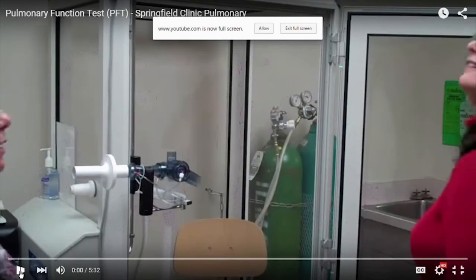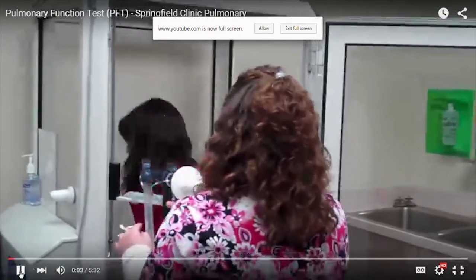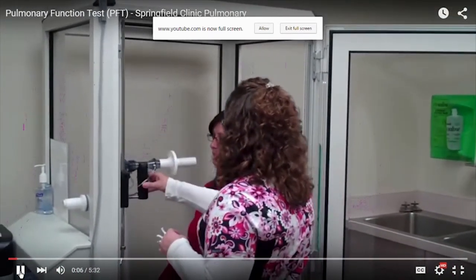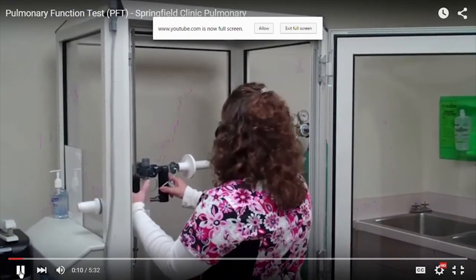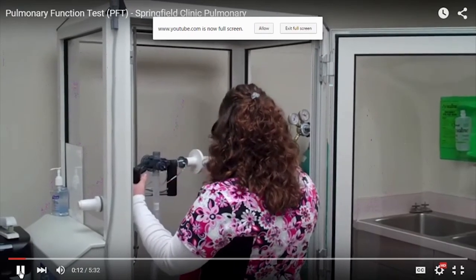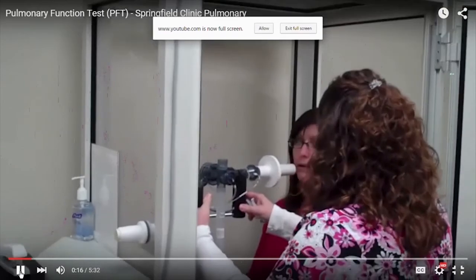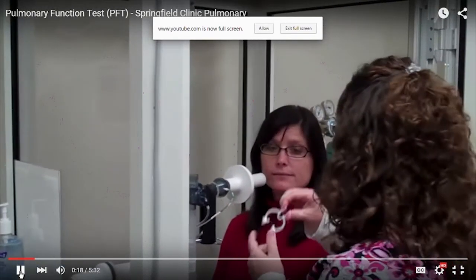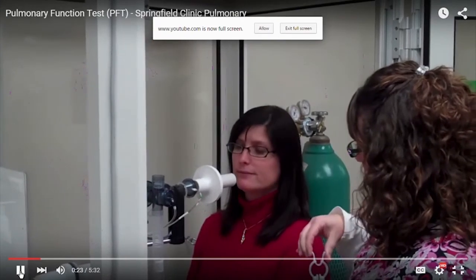Hi, I'm going to have a seat in the booth. This is pulmonary function testing. We'll be assessing patients' different parameters of their lung function today. Okay, this is the mouthpiece. Your mouth's going to go all the way around that. You're going to have a nice tight seal with your lips. These are the nose clips. I'm going to plug your nose off so I can make sure everything's coming from your lungs and not your nostrils, okay?